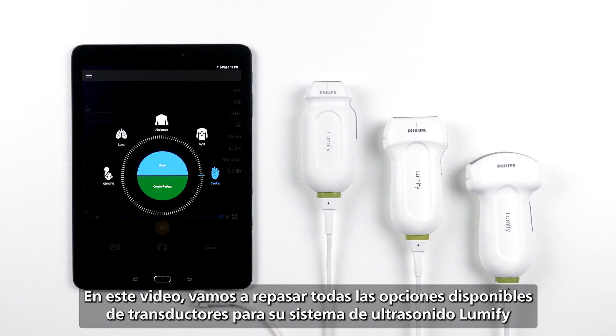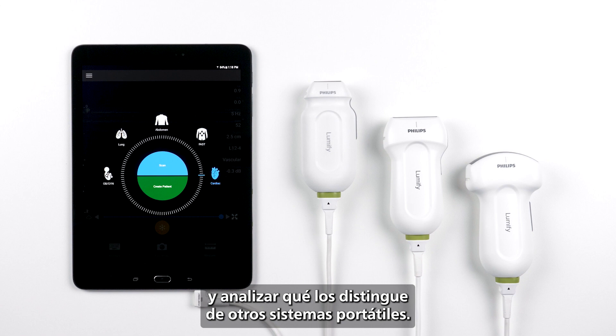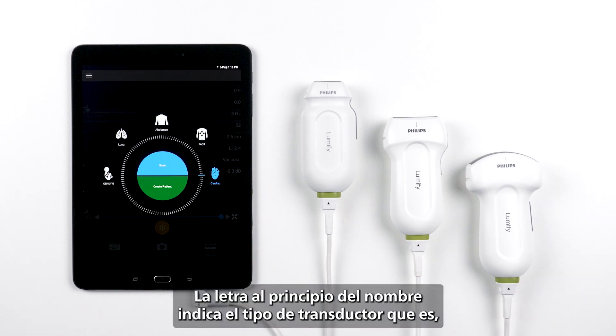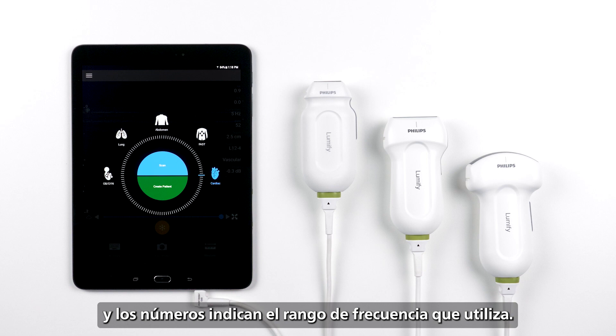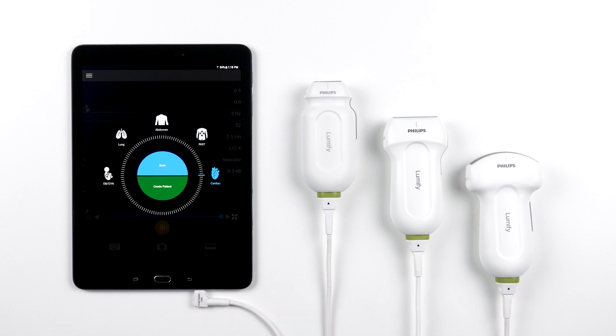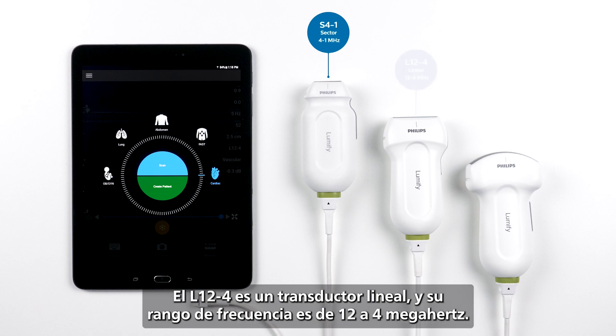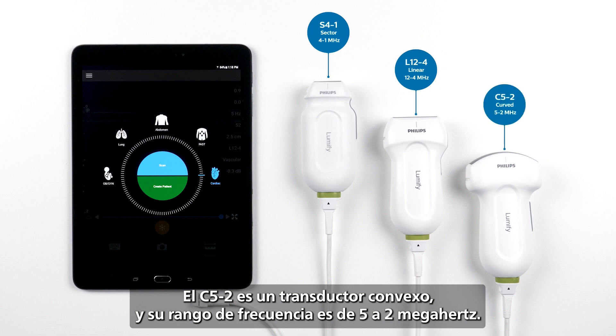In this video, we are going to go over all of the available transducers for your Lumify ultrasound system and discuss what sets them apart from other handheld systems. To start, let's review how the transducers are named. The letter at the beginning of the name tells you the type of transducer it is, and the numbers tell you the frequency range it uses. So the S4-1 is a sector transducer with a frequency range of 4-1 MHz. The L12-4 is a linear transducer with a frequency range of 12-4 MHz. The C5-2 is a curved array transducer with a frequency range of 5-2 MHz.